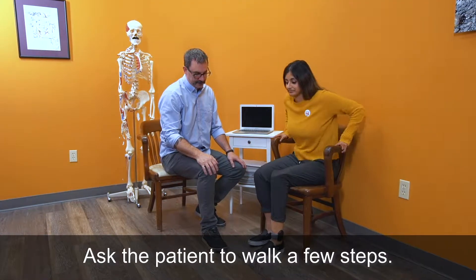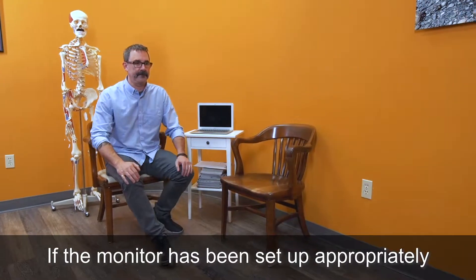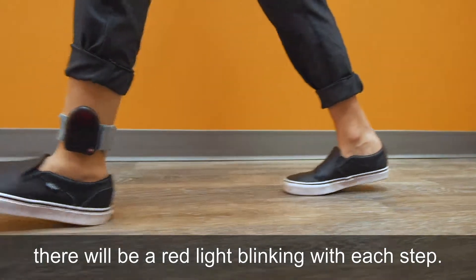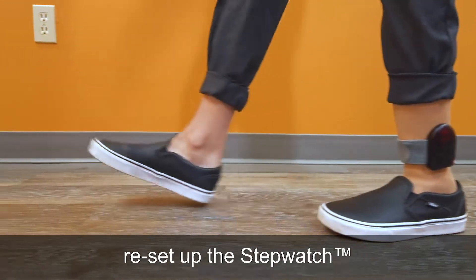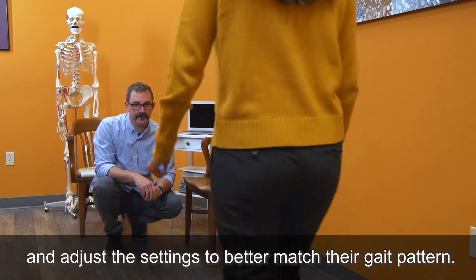Ask the patient to walk a few steps. If the monitor has been set up appropriately, there will be a red light blinking with each step. If there is no blinking light, reset up the StepWatch and adjust the settings to better match their gait pattern.